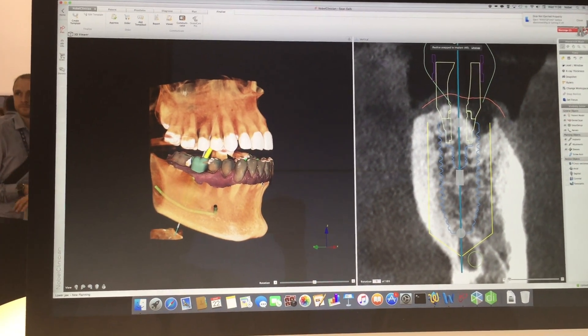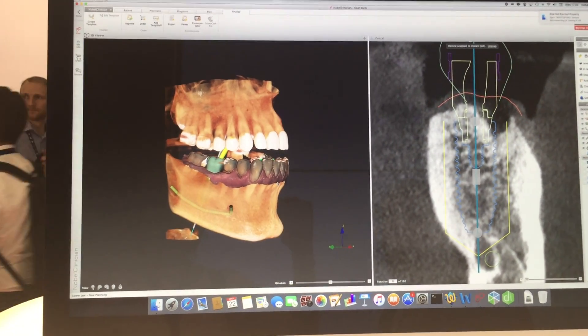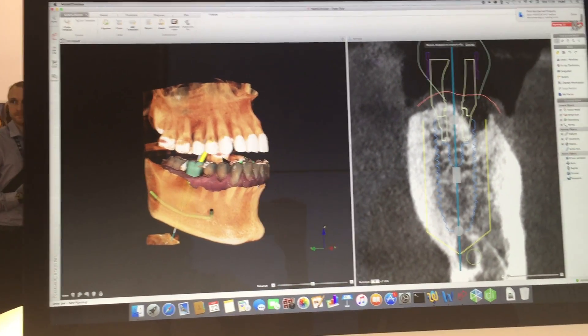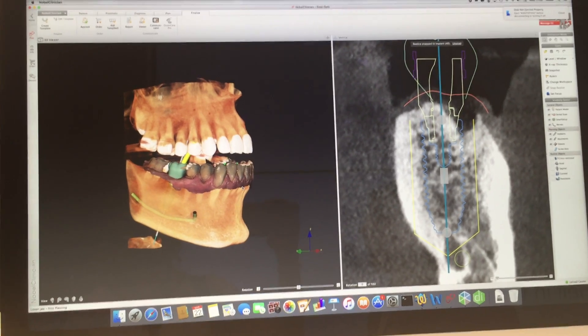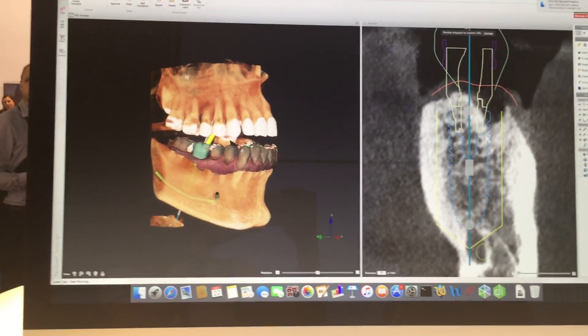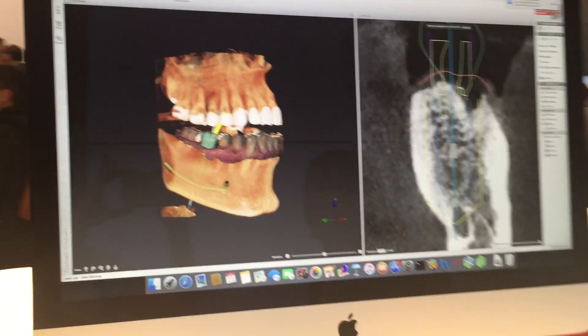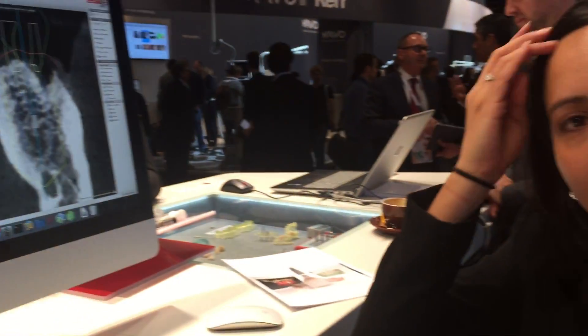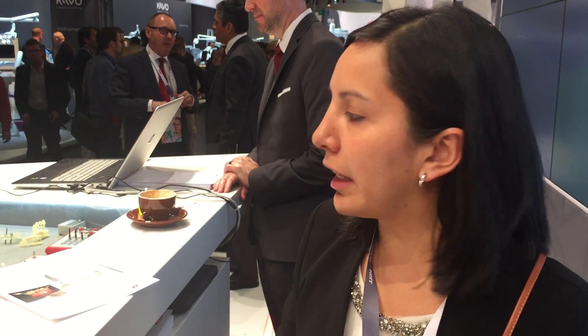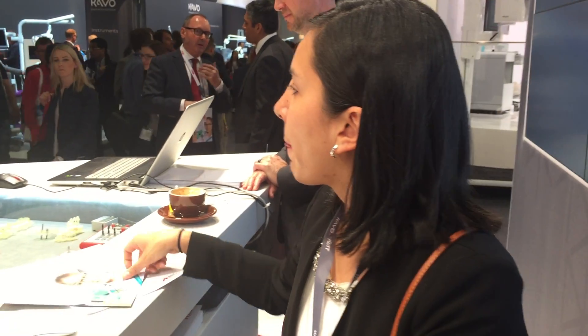All this data can be transferred to NobelDesign, so lab technicians can support with the design of the prosthetic restoration, and a TempShell is created to support immediate loading.